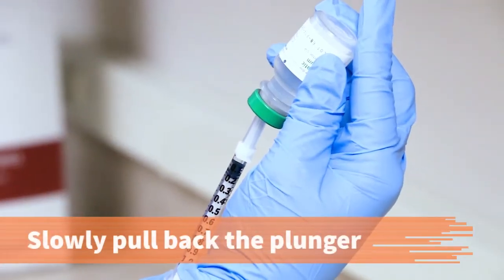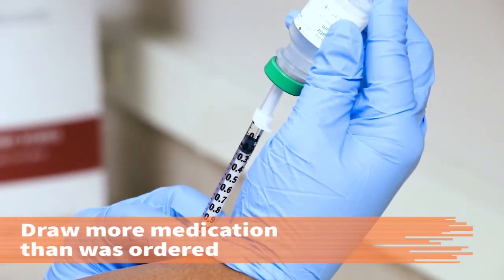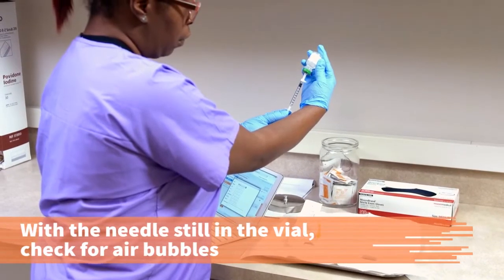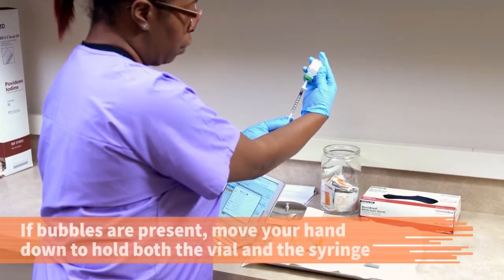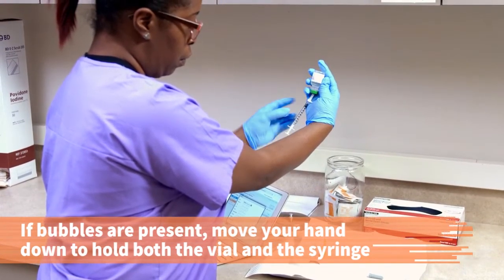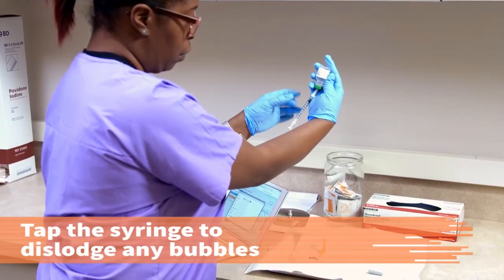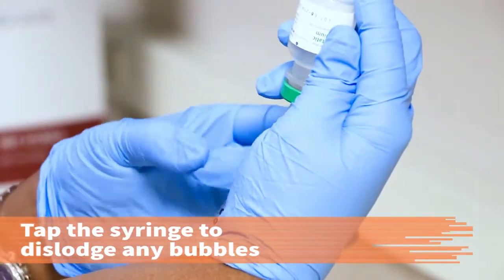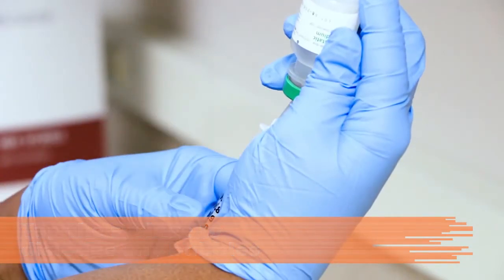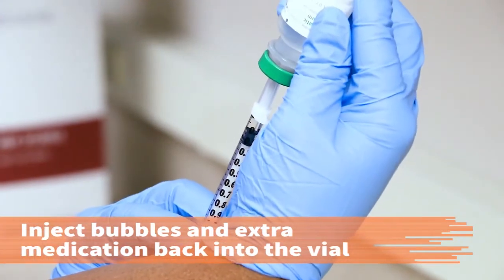Slowly pull back on the plunger with the unit at eye level and draw up more medication than ordered into the syringe unit. While the needle is still in the vial, check for air bubbles in the syringe. If air bubbles are present, move the fingers holding the vial down to grasp the vial and syringe as a single unit. With your dominant hand now free, use it to tap the syringe until the air bubbles dislodge and float into the tip of the syringe. Inject the air bubbles back into the vial with the extra medication that was withdrawn.